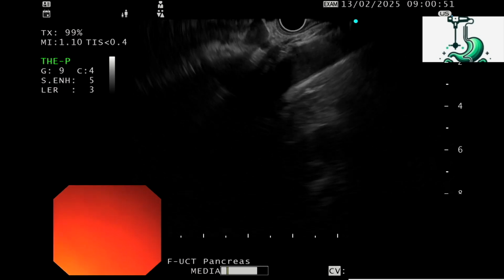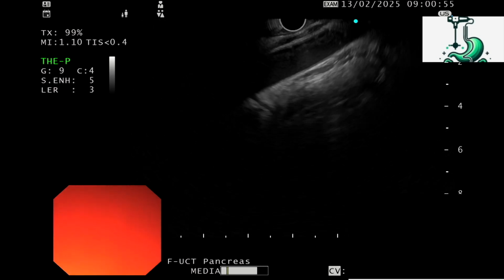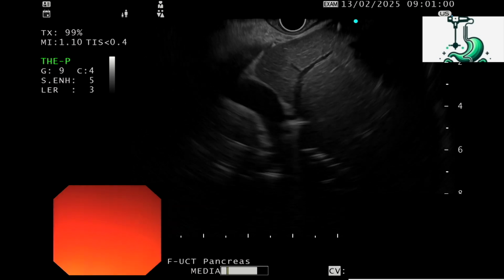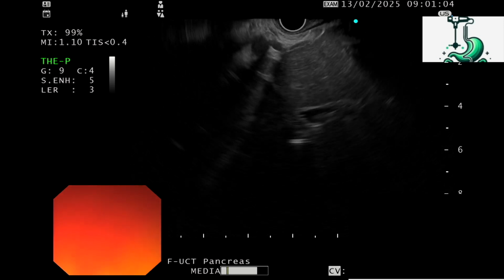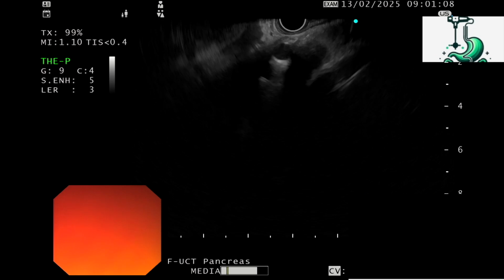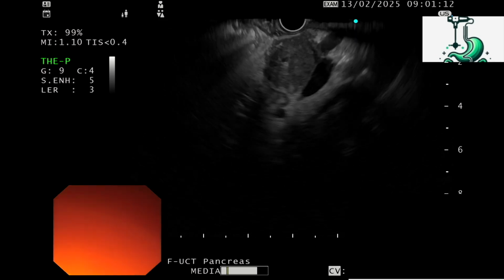Endosono, diagnostic endosono. I'm seeing the posterior aorta, and anteriorly I can also see the liver. So you can start the interrogation of obstructive jaundice at the G junction. I'm seeing this aorta and the celiac take off, and then I push the scope and I can see the pancreas over there.